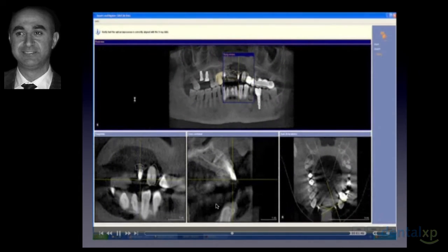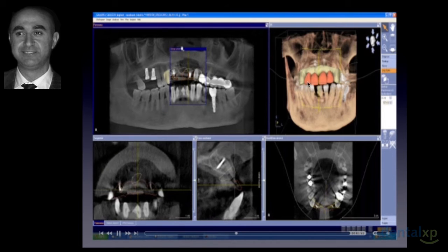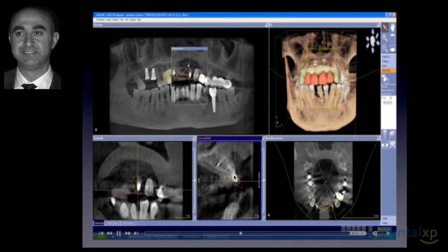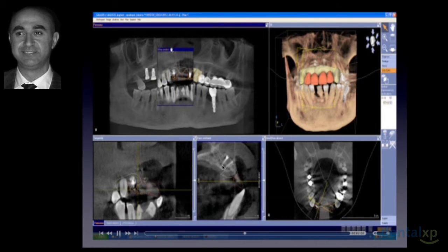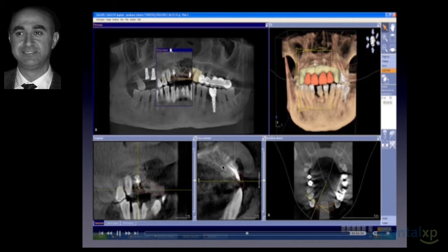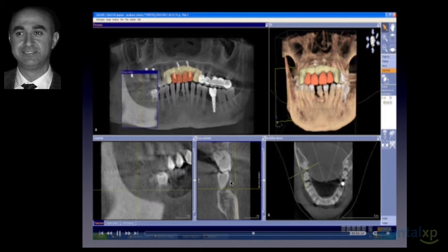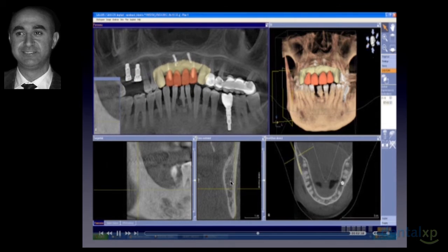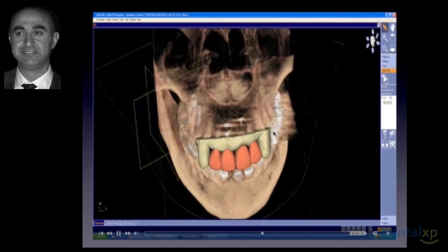And then you can even show from this 3D rendering, as you can see here, where exactly the teeth are going to be. It gives you an idea if we enlarge and magnify one of the cross-sectional cuts at the block grafts. All this is before placing the implants itself. It gives you an idea where the tooth or the prosthetic or the final crown should be on the implant that will be placed. And as you can see, it's according to occlusion.